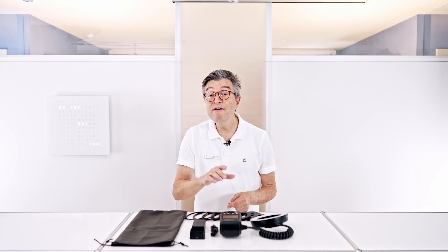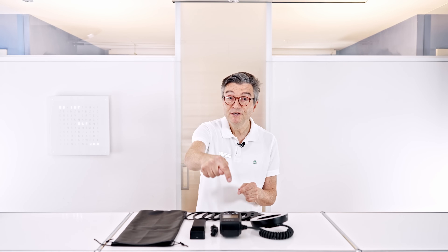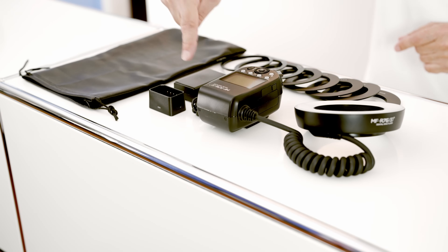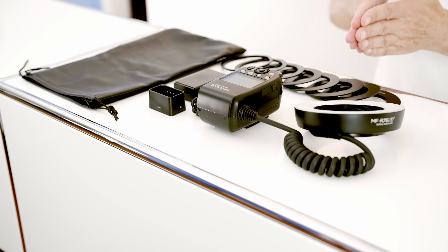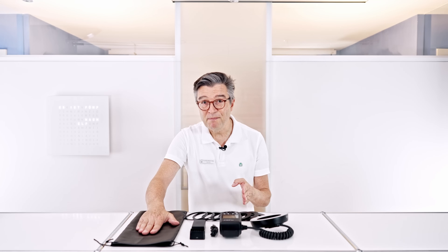The Godox MFR76 Dental Ring Flash Kit comes with a controller, flashlight, cable to charge your battery, the battery charger, adapter, a set of adapter rings to mount your flash on the lens, and a transport bag.